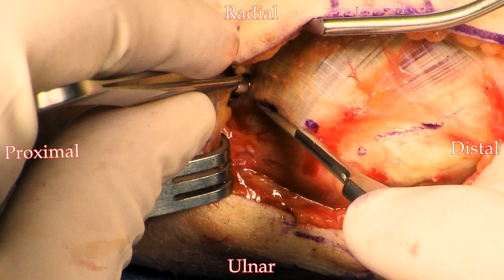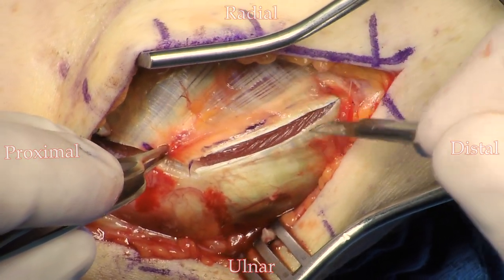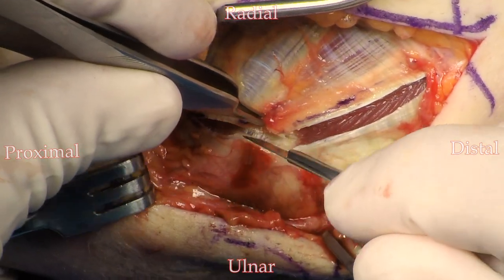The interval between the flexor carpi ulnaris and the palmaris can be sometimes challenging to find. The flexor carpi ulnaris tends to be more tendinous in this area, and the palmaris is a little more muscular, so you can find that interval. If there's any question, just take your muscle split a little bit more posteriorly rather than anteriorly.